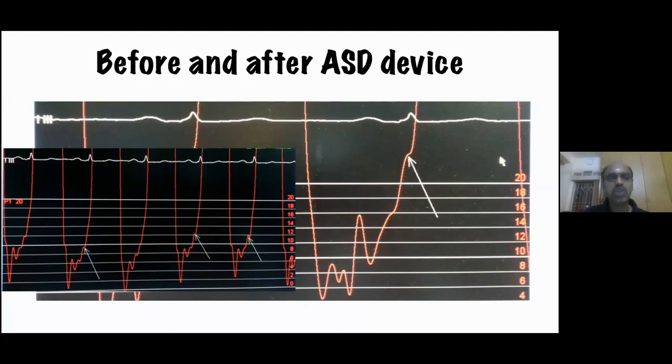So in this particular patient, the cardiac output is being maintained at normal LV filling pressures. Such a patient, after closure of the ASD, is unlikely to have a significant elevation of the LV-EDP to contraindicate a closure.